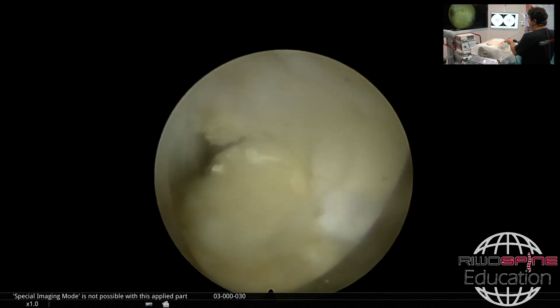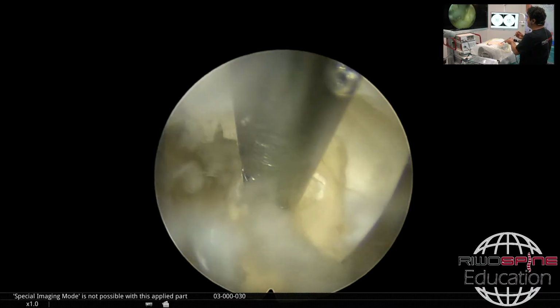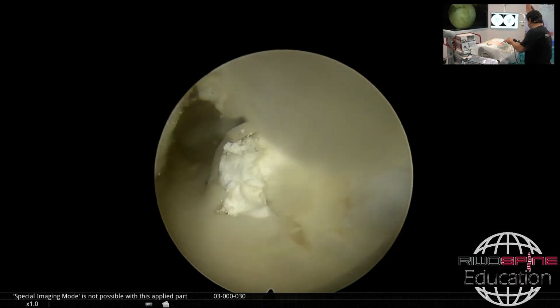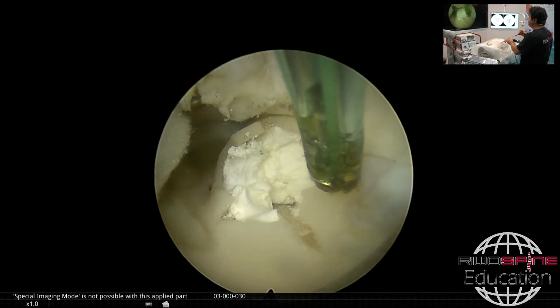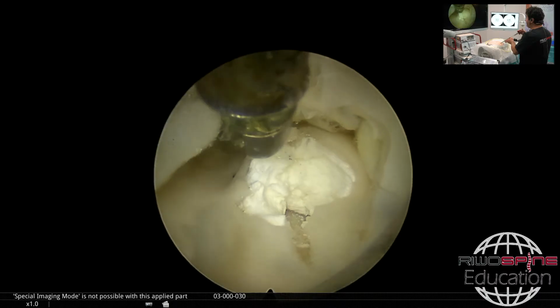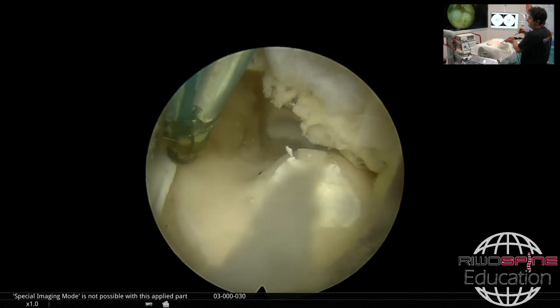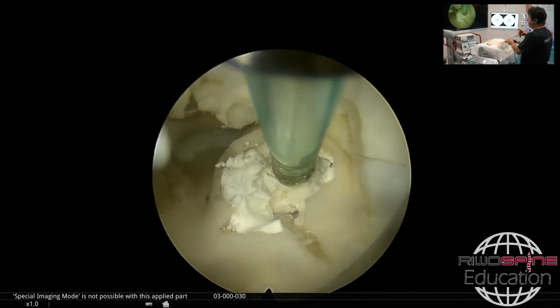Again, like that, the most common extraforaminal herniations are located in the cranial side, push the exiting nerve root outside to the posterior part, and then in this case you can stay outside. Even if this foramen is narrow or not, I don't care about it, because if I rotate my system to the cranial side, I can easily reach the extraforaminal area like that. Then I will never have any problem with the narrow foramen. Narrow foramen is always the problem.